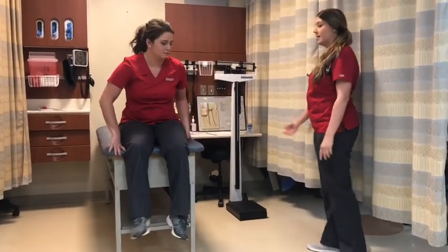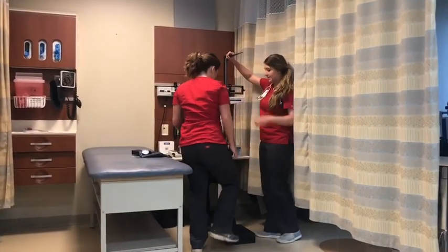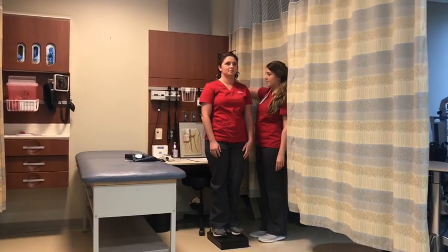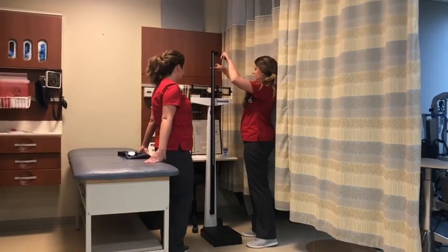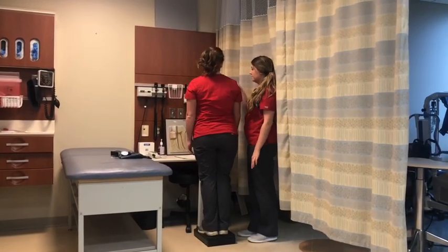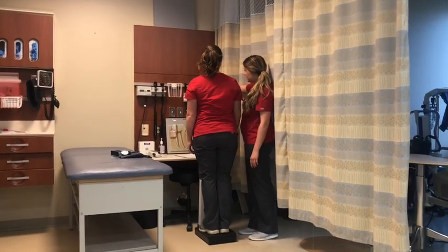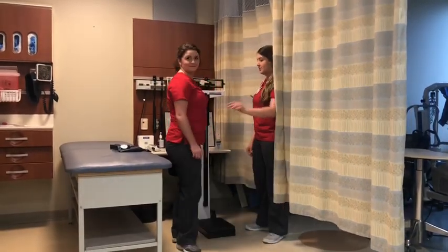Can you come over here and I will get your height and weight? Step on for me, face that way. Is that snug on your head? Yep. Okay, go ahead and step down for me. Patient is 5'6". Now can you step on and we'll get your weight. Patient weighs 137 pounds. Go ahead and step off for me.